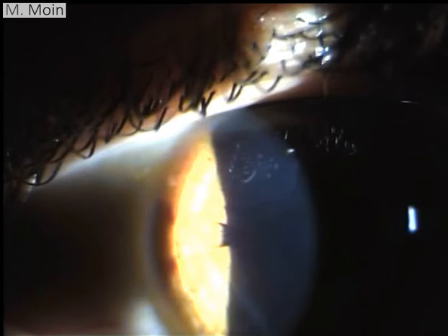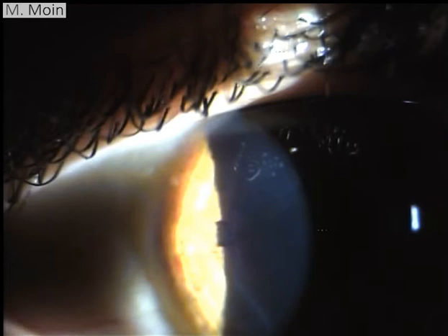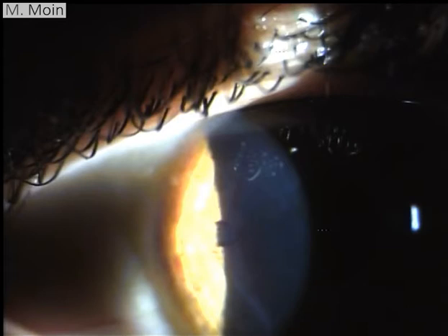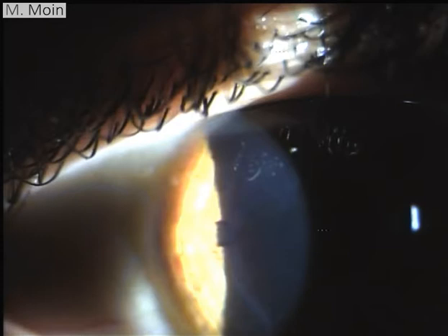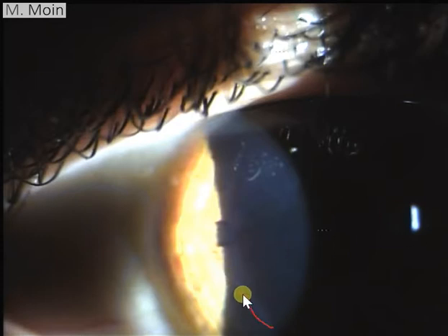Welcome to this video in which we will show you a case of the anterior segment. This is a patient who had undergone refractive surgery, LASIK surgery many years ago in another center, and he had come in for routine examination.